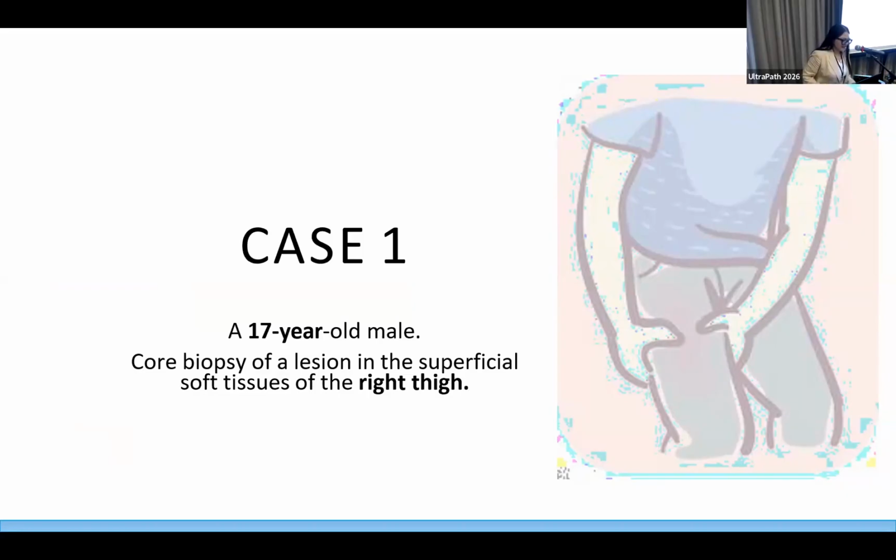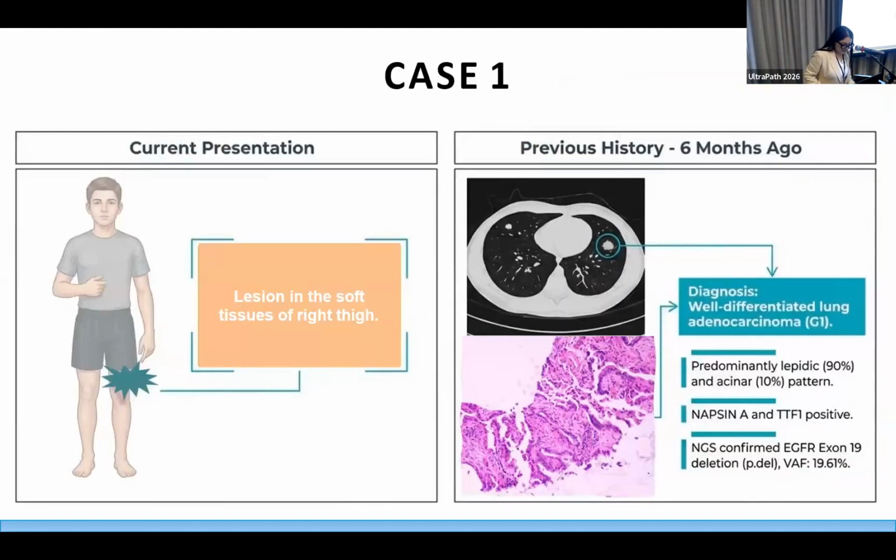So this is the first case, and this is a 17-year-old male, and we received a core biopsy of a lesion in the superficial soft tissues of the right leg.